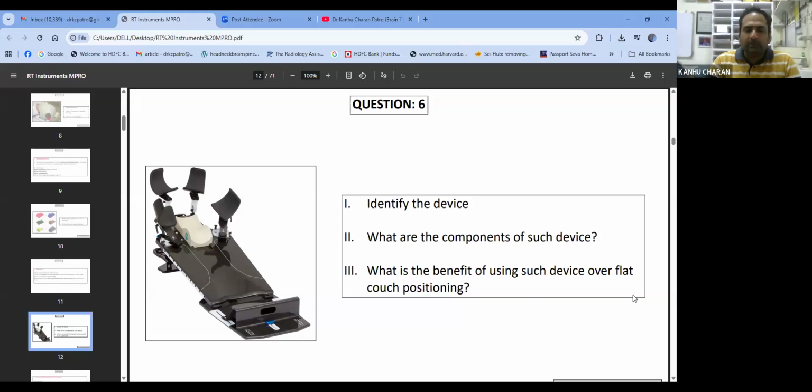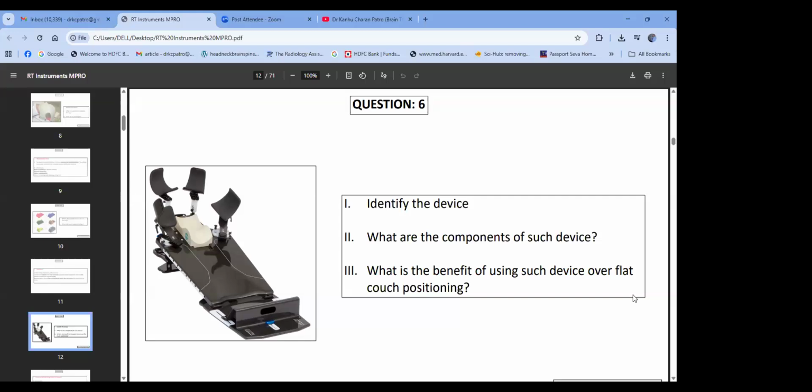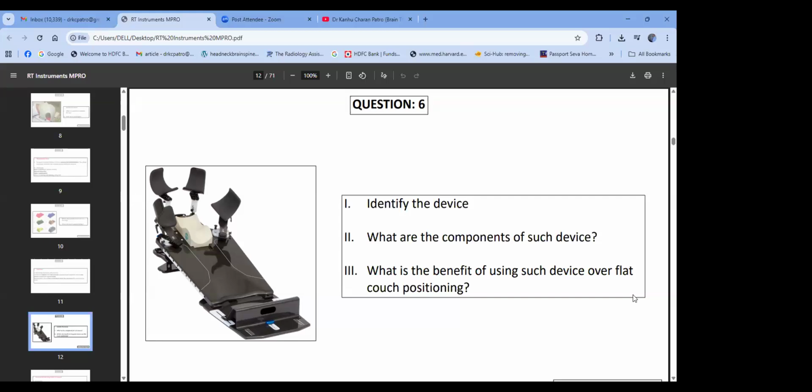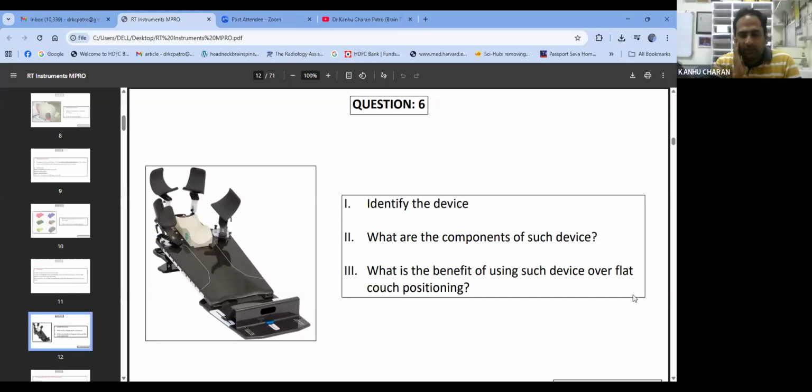So you talked about breast radiotherapy, the immobilization device, breastboard. Along with which radiotherapy techniques is this used, or with other techniques this is not required? Sir, I did not understand, sir. So will you use a breastboard when you're planning VMAT or IMRT? No, sir. That will also decrease heart and lung dose. No, that's not exactly that.